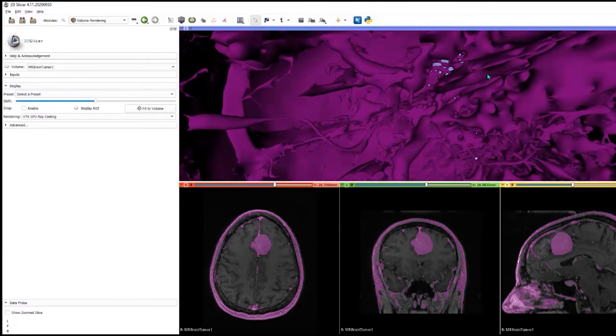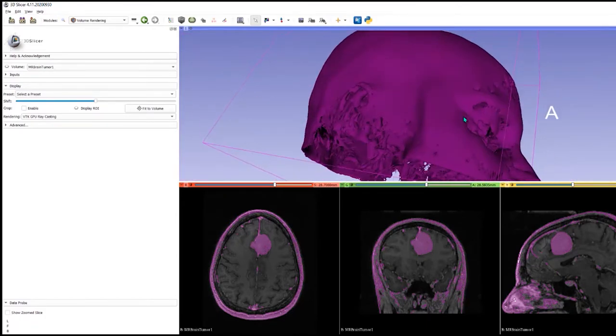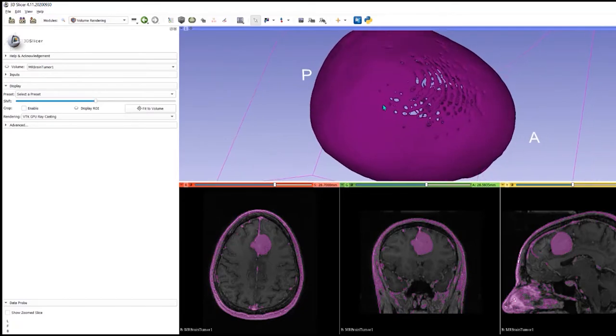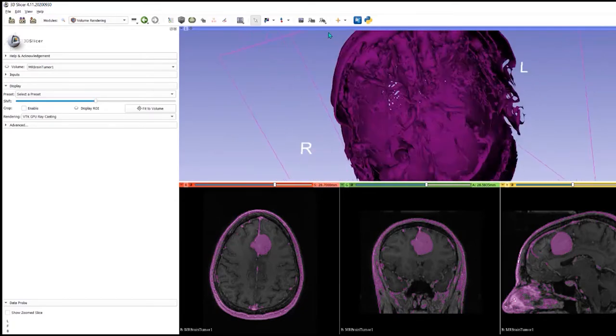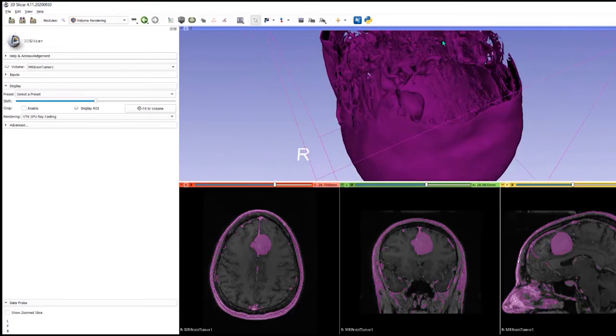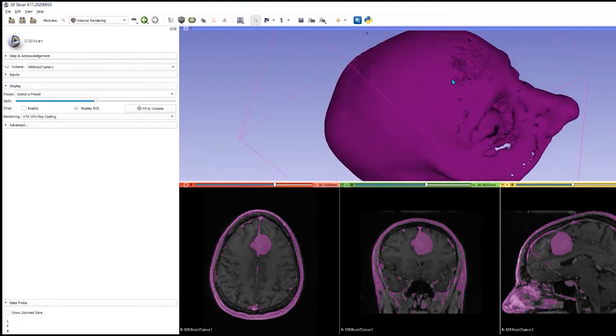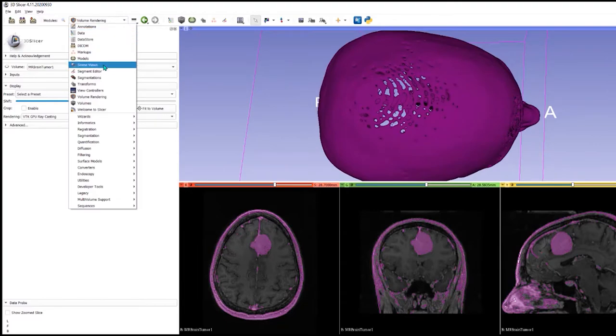But we've got all this other stuff as well which we don't necessarily want. If we had an algorithm that was trained to only see the tumor, that would help, and that's what I want to demonstrate next.